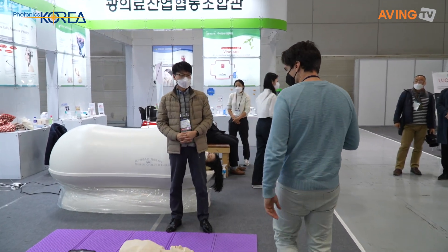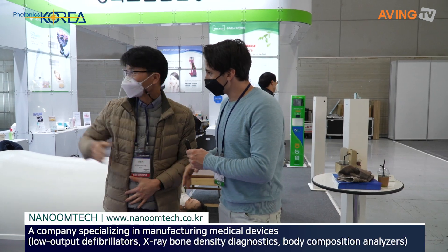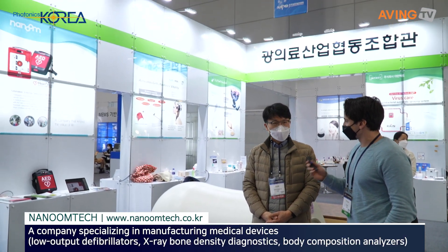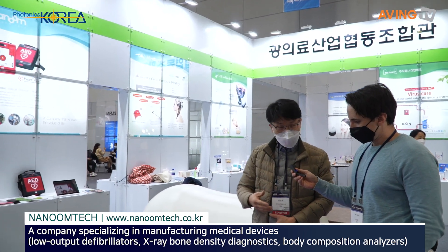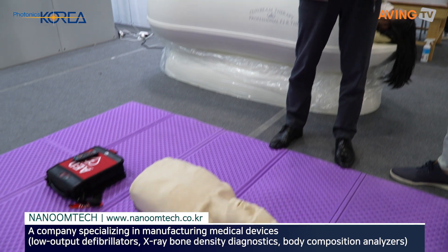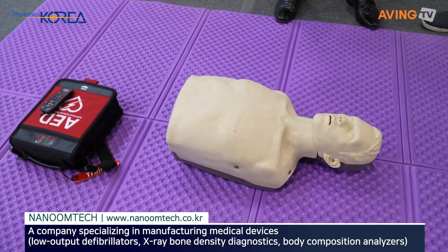Hello. How are you? Nice to meet you. Nice to meet you, too. I'm from Nanum Tech. What is Nanum Tech? We are the manufacturer of AED, like a defibrillator. There's a defibrillator down here right now. Have you seen this product before? I've never used it. I've seen it.